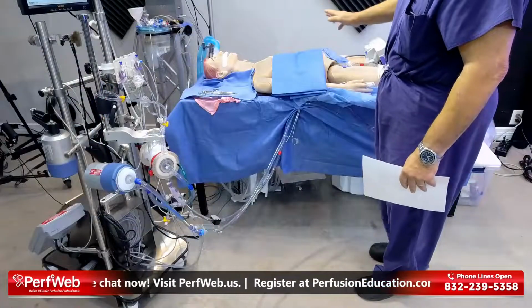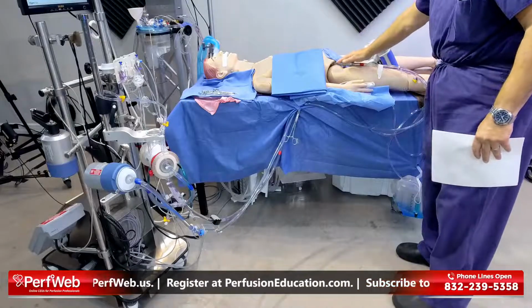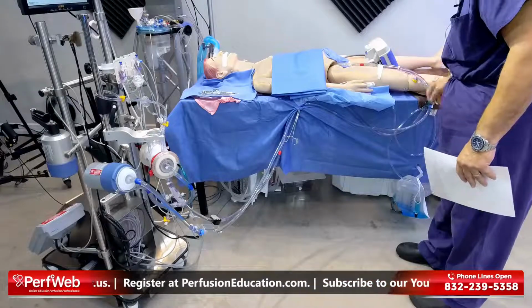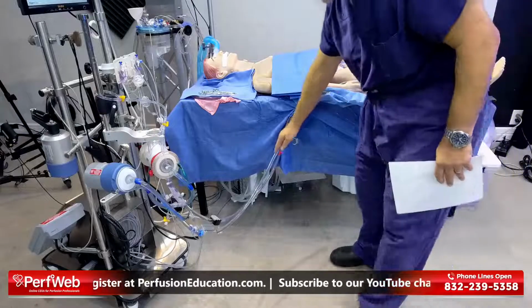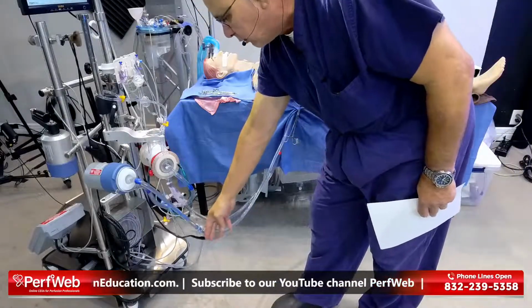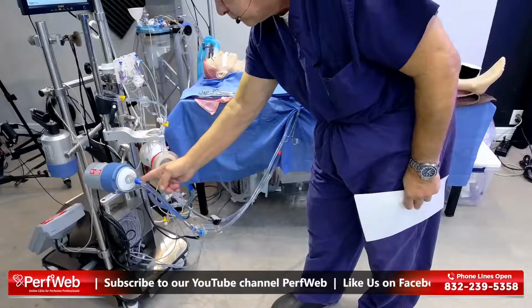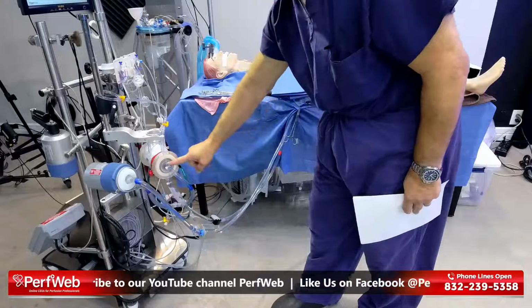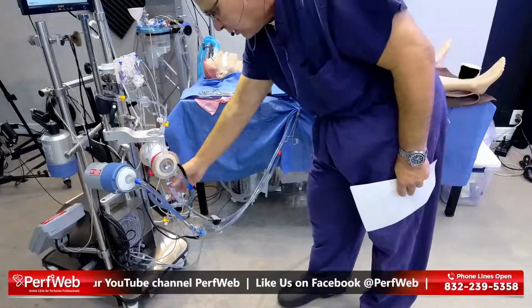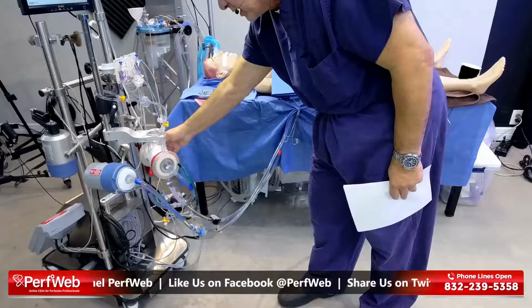So let's take a look at our basic ECMO circuit if we can. We have the venous line coming out here. We'll follow it down. It comes through a bubble sensor here. This is where we monitor our access pressure into the centrifugal cone, out of the centrifugal cone, into the oxygenator. Now, here's the oxygen line. Heat exchanger connection would be in the back.